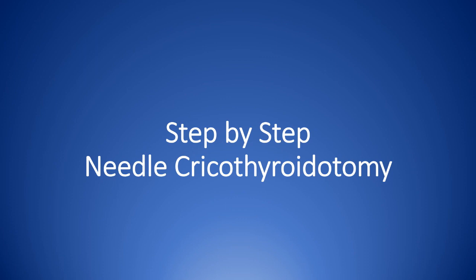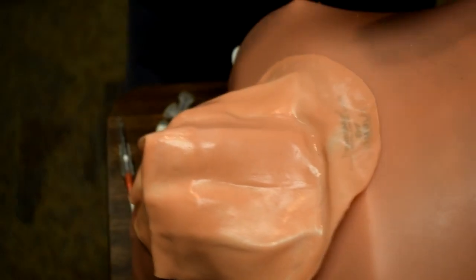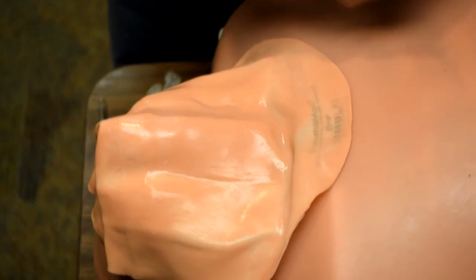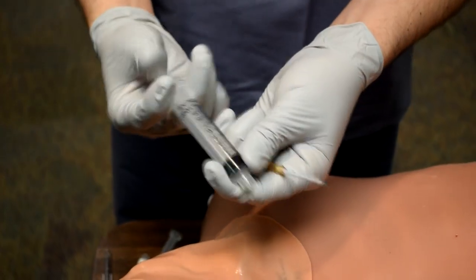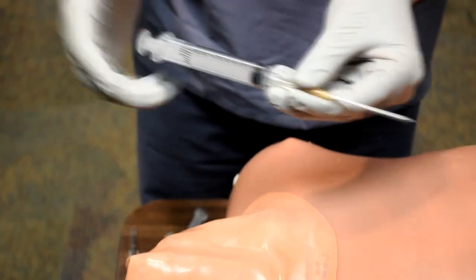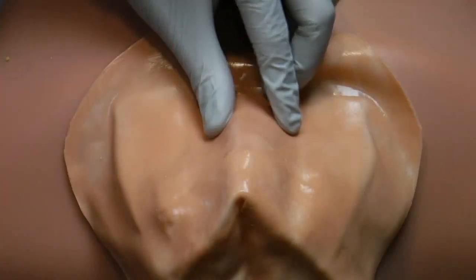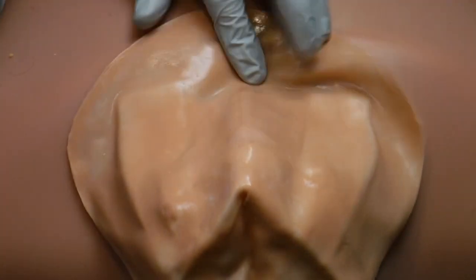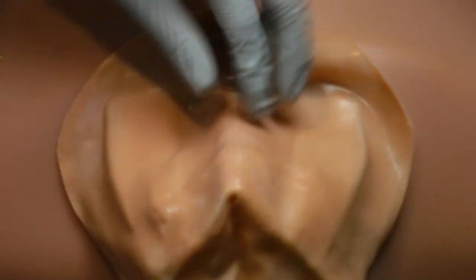So let's now demonstrate this procedure with all the steps. Once again, this is for a child under the age of 12. So we're going to have our angiocath ready with our needle, and here we're going to demonstrate the angiocath where we can attach a syringe to the back of it. I'm going to set up our syringe again, and remember it can be a 5, a 10, or a 20. We have our syringe here, and in this situation I am a right-handed surgeon, but because I'm doing a needle cric, I want to stand on the left side of the patient. I'm going to feel my anatomy, and I can feel again the sternal notch, the trachea, the cricoid cartilage, the divot of the cricothyroid membrane, and the thyroid cartilage.